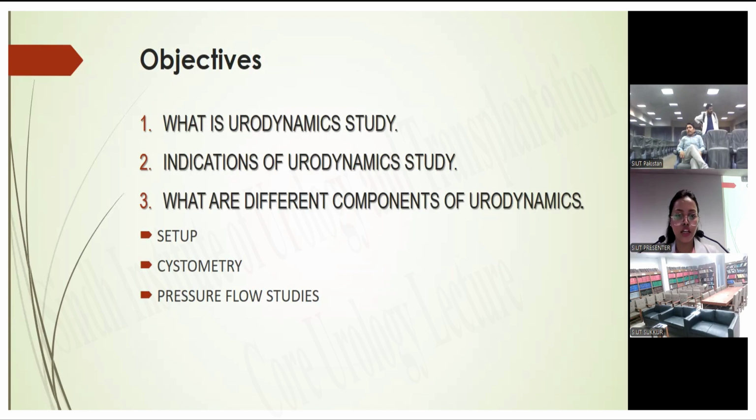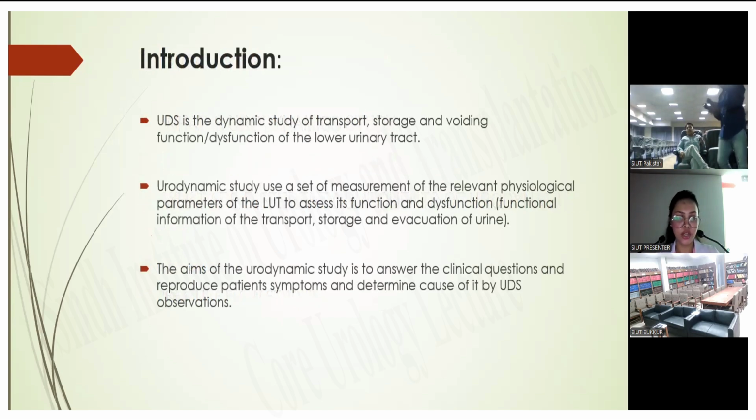The objectives for today's discussion will be the urodynamic study, its indication, different components of urodynamic studies, its setup, cystometry, and pressure flow studies. Introduction.